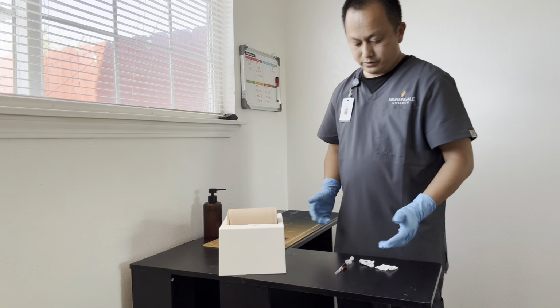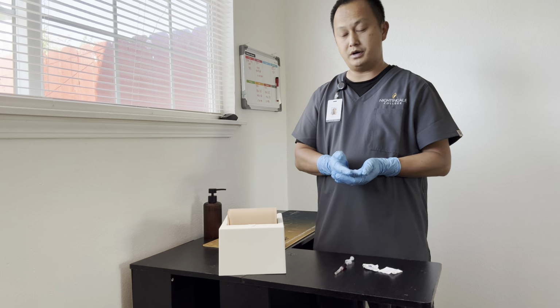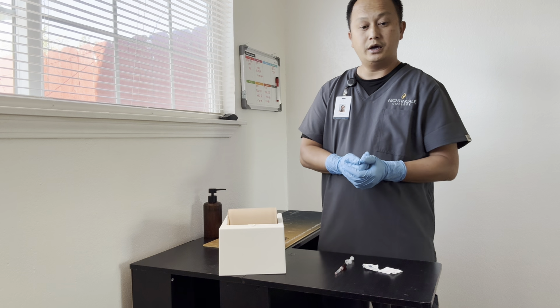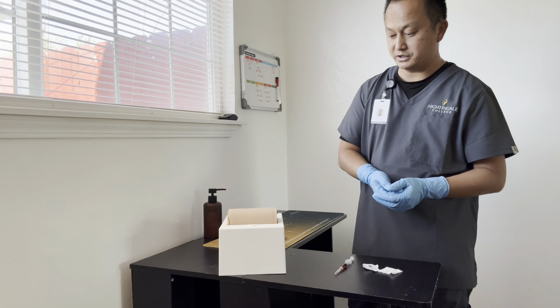After drawing up my medication, this is a good time to verify my doctor's order again in the MAR to verify we have the 6 patient rights. Okay, everything looks good. Now I'm just going to have my patient go ahead and lay on their side since we are using the ventrogluteal area. I will ask for consent from my patient before exposing the patient.